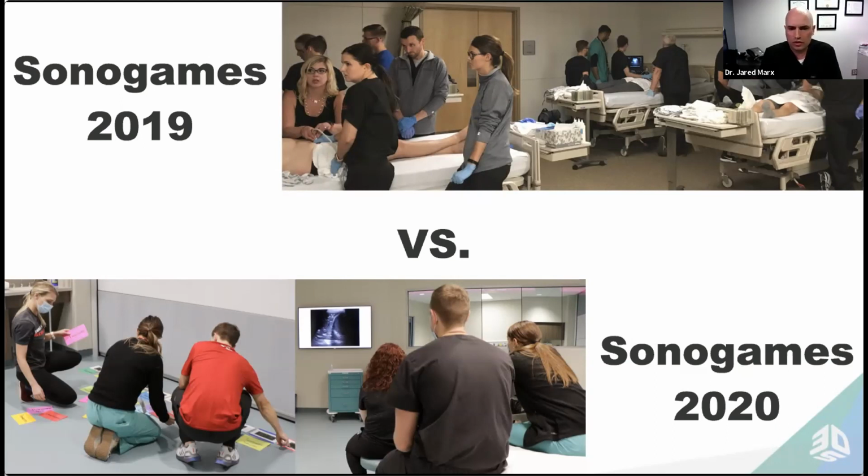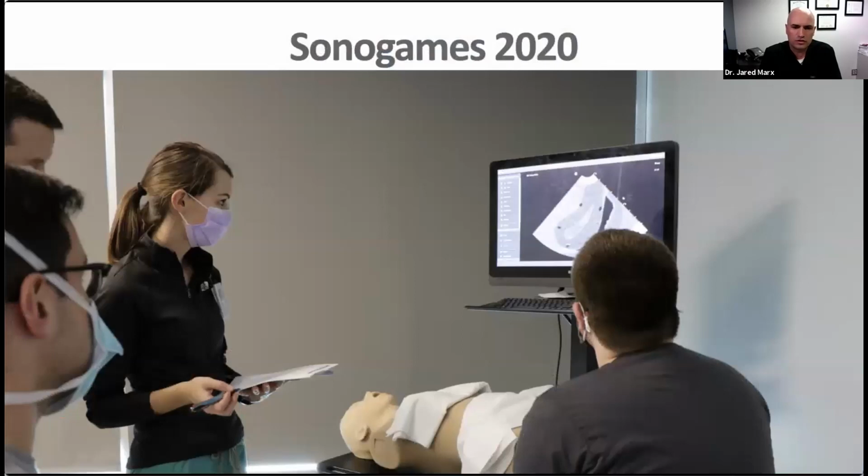Obviously, one of the things we're able to continue to use during these types of events is our simulators. Here we see the 3D ultrasound systems as we use that for education for our transvaginal ultrasound. And I think we're doing pretty good at returning to that. Obviously not back to our normal, but doing that.